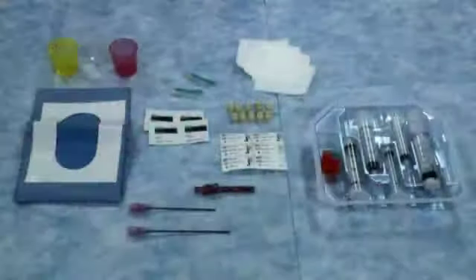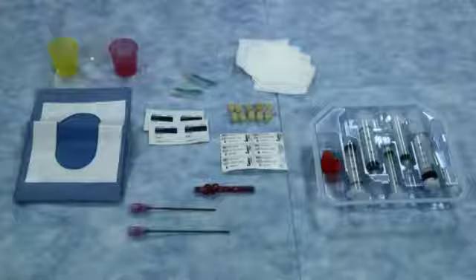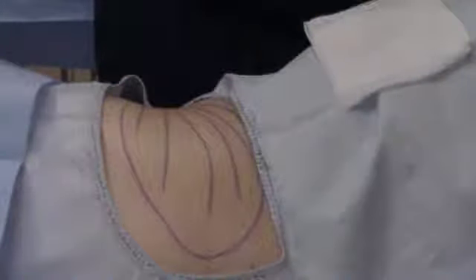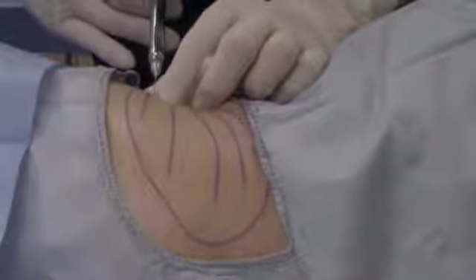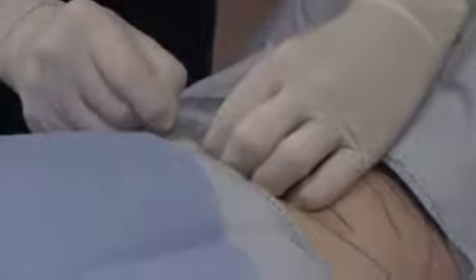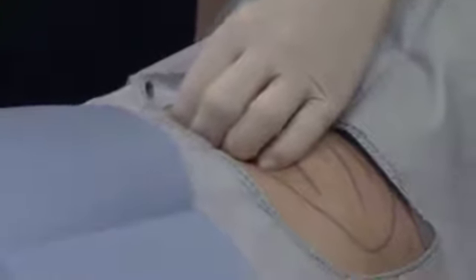Prior to the start of lipoaspirate processing, all contents within the procedure pack should be opened within the sterile field. The donor site should be prepared following sterile and aseptic technique. A sterile drape is provided to isolate the donor site. Anesthetize the donor puncture site with the 25-gauge needle provided. Create a puncture hole through the skin only using the 18-gauge needle. This opening provides an access point for the lipoaspiration cannulas.